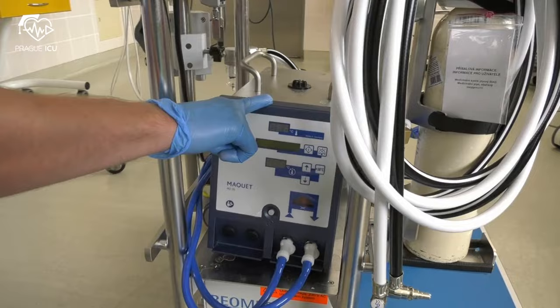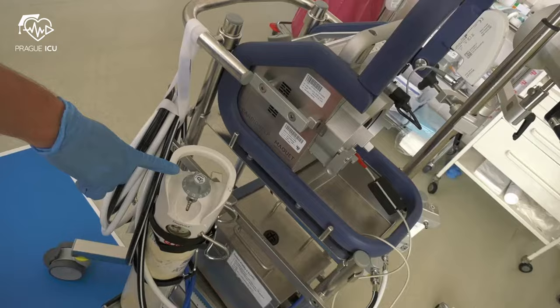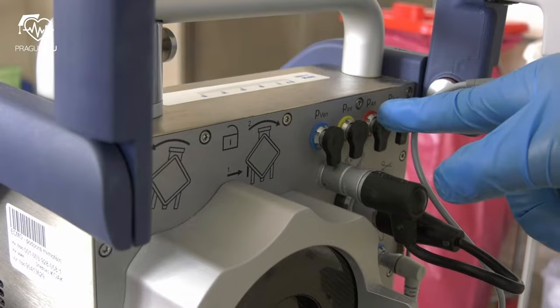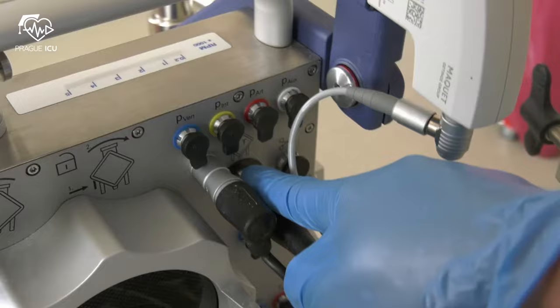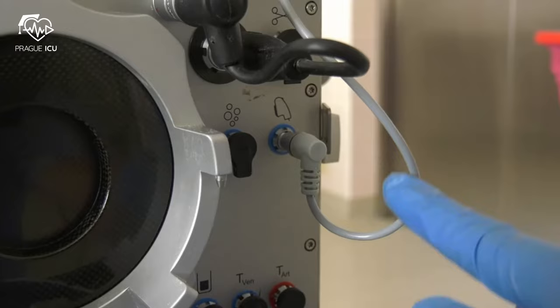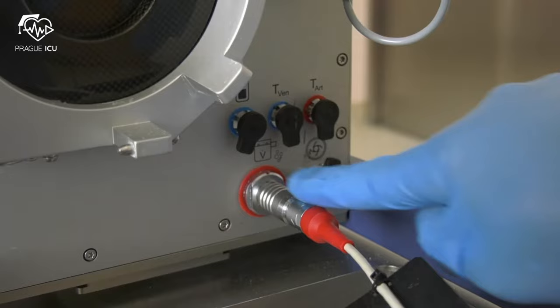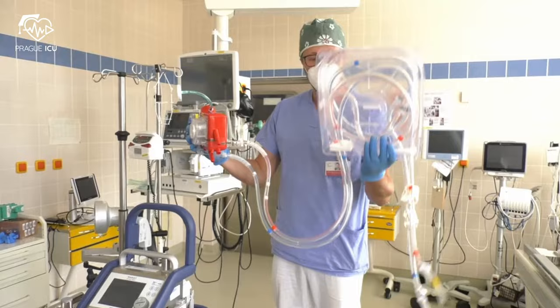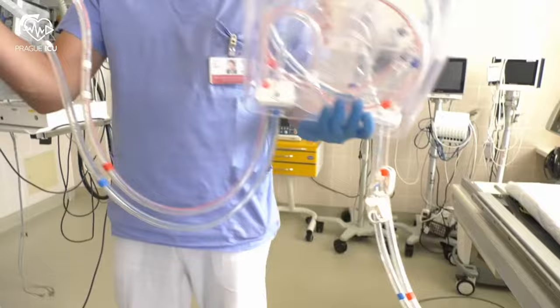First of all, let's describe our ECMO set. This is the Cardiohelp Maquet device: heating unit, Cardiohelp emergency drive with support, gas blender, oxygen cylinder, the venous probe for external pressure sensors, connection for integrated pressure sensors, connection to venous probe, flow bubble sensor.